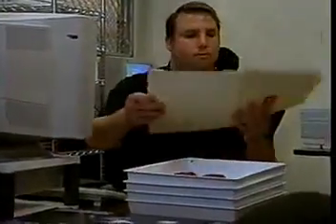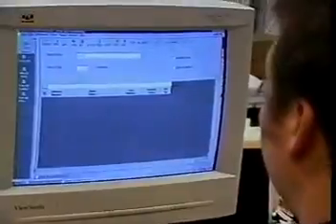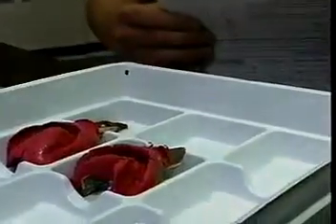The Invisalign process begins much like it does with traditional braces, with the orthodontist making an initial diagnosis and mapping out a course of treatment. Then these are sent to Align Technology, along with the patient's x-rays and impressions of the patient's teeth and bite.